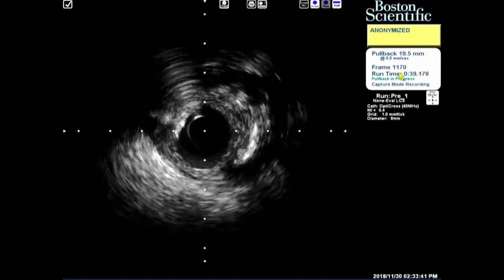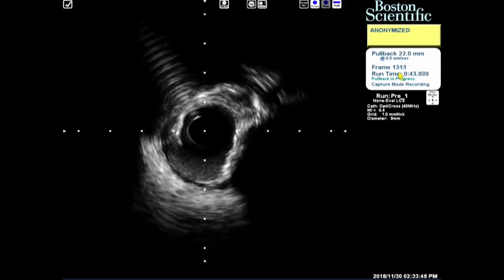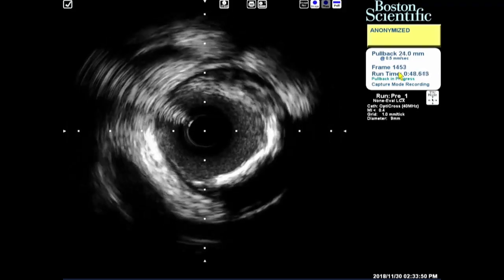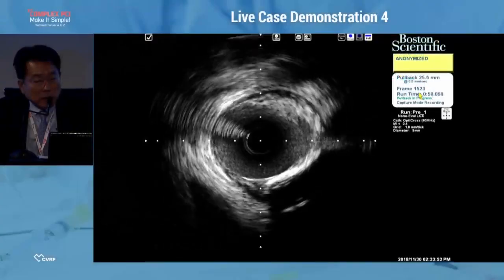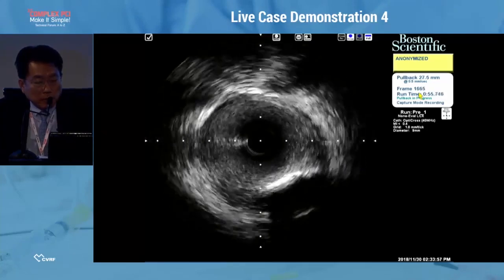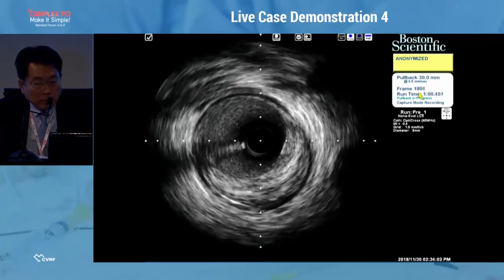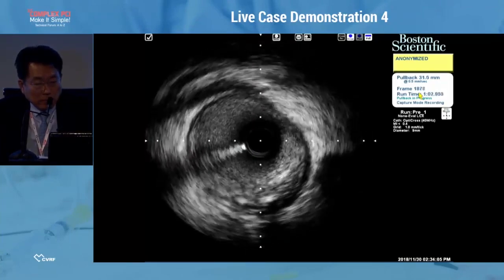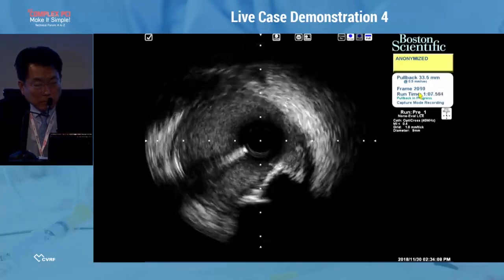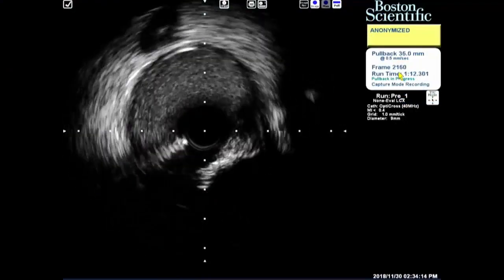Tightest portion? Yeah, here is possibly the minimal lumen area of the circumflex. Tightest portion would be minimal lumen area, 3 or something, right? Yeah. We'll check those measurements. That's almost it. And the other important point is the circumflex ostium. Just approaching the left main. Big, huge.